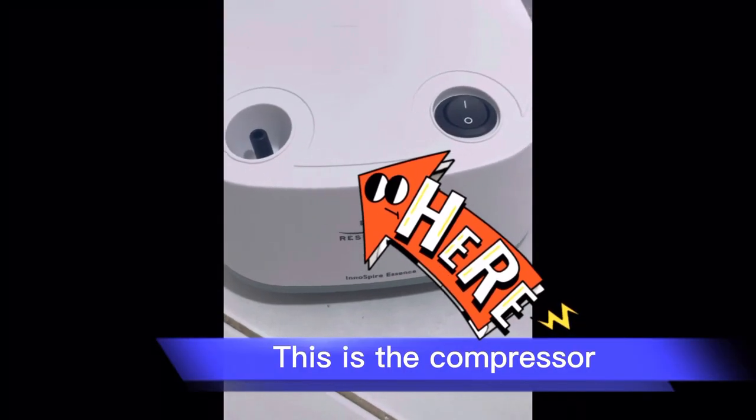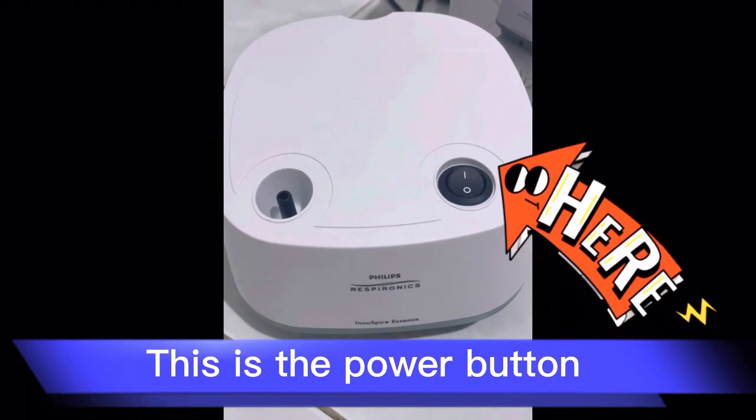This is the compressor. This is the power button.